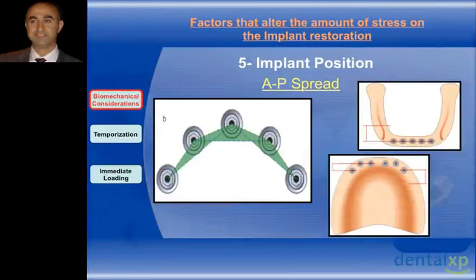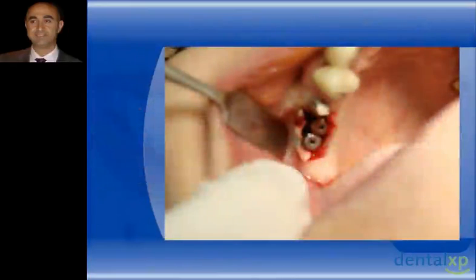like in cases of a square shaped arch, or whenever we're placing 3 or 4 implants in a unilateral position, like the previous case in sinus elevation, we try to place one of the implants out of the straight line to create the tripod itself, to counteract any forces. As you can see, again, tripoding.